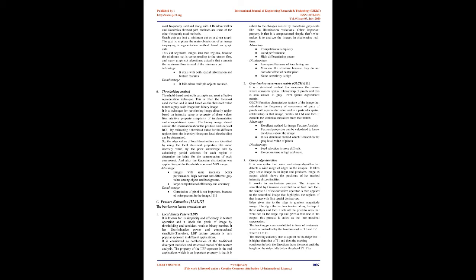The essential features like axial shape, texture-based information, gradient etc. in the image domain are extracted using the contour-based technique. Advantage. It will control cavities, concavities, convolution, splitting or merging. Tuning is simple and easy. Disadvantage. It will add unwanted information like noise in the image. It leads to blurring, weak boundaries, edges and reduced contrast.